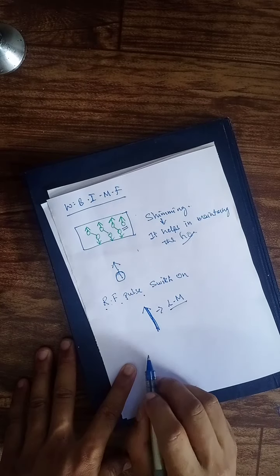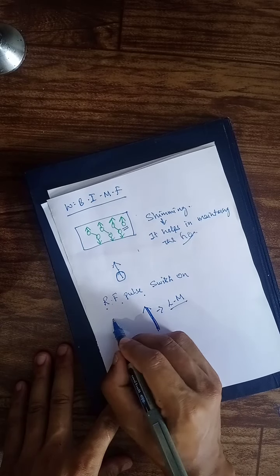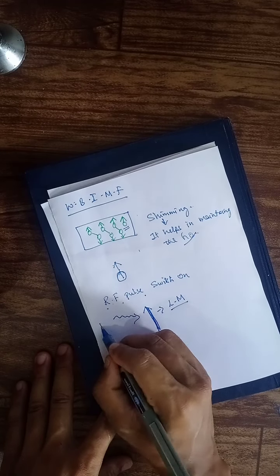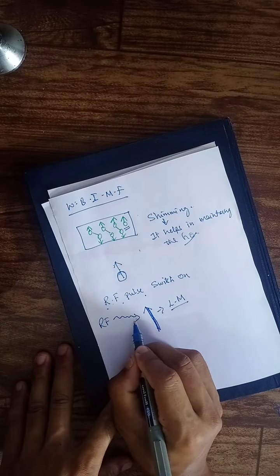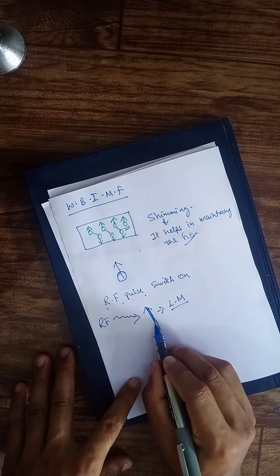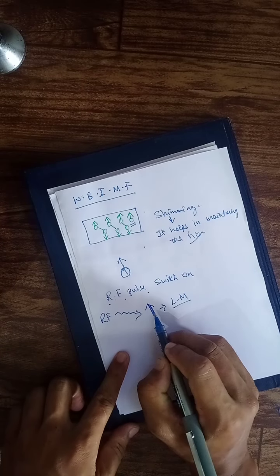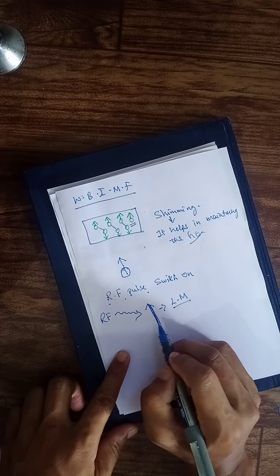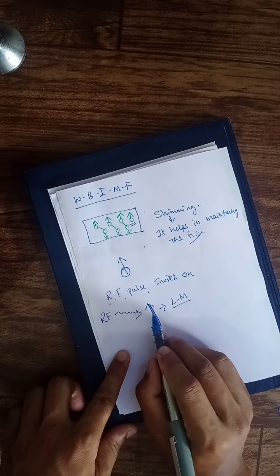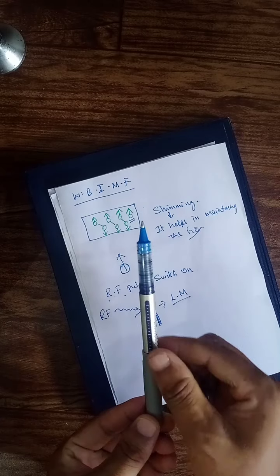When the RF pulse comes and strikes your longitudinal magnetization, or simply you can use the word proton, what will happen? It's gonna flip.